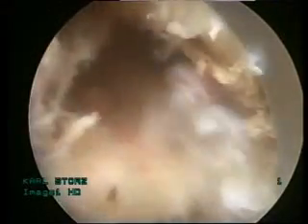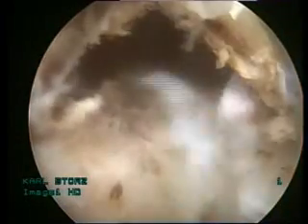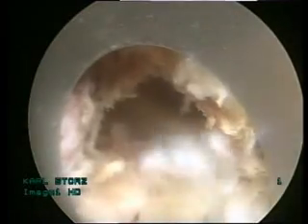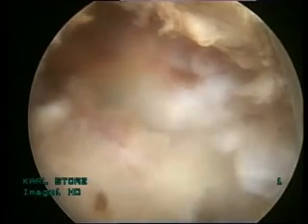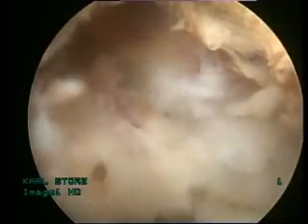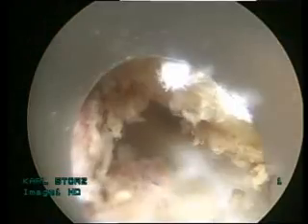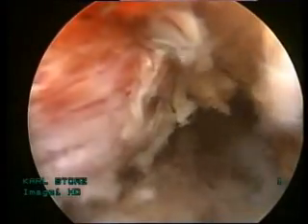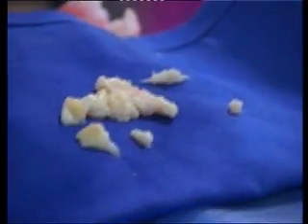The axilla is confirmed free of any fragment. There is a small ooze which can be controlled with an irrigation pump. The axilla is shown with the L4 root on the left and the pulsating dural sac on the right side crossing the picture. The annular tissue is visible in the middle part of the picture with the disc at the lower portion. The cannula is rotated anti-clockwise to show the exiting root seen on the left.